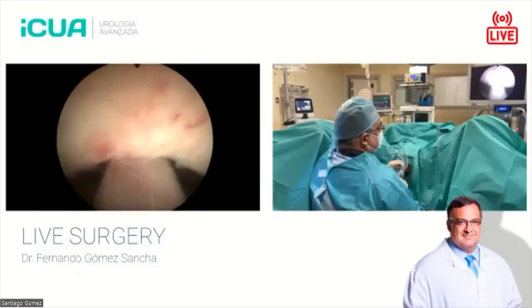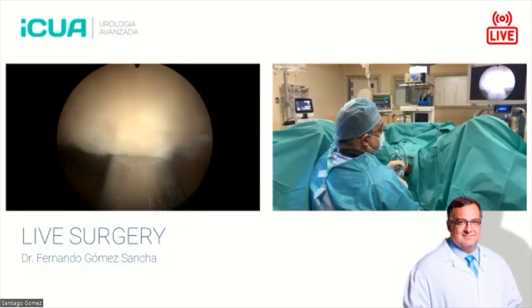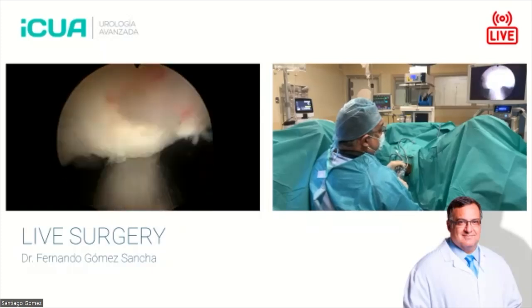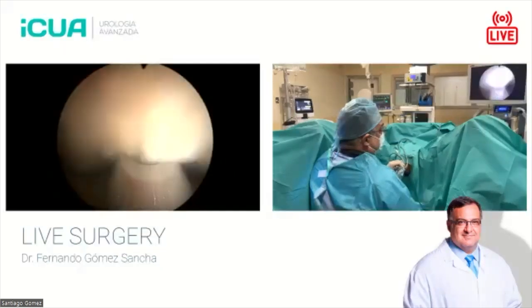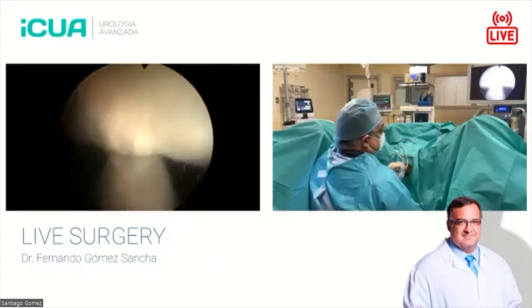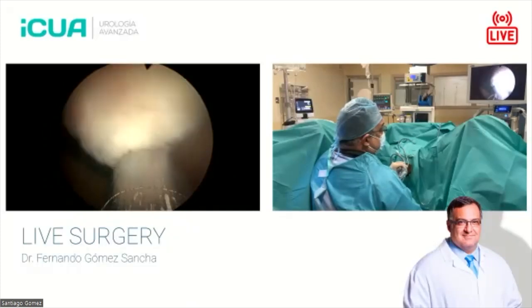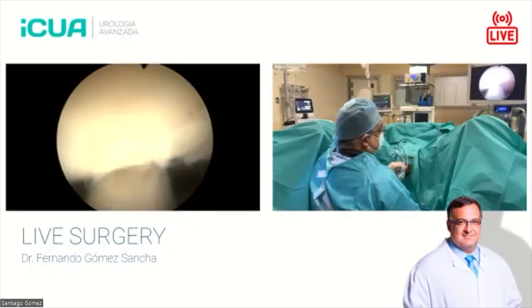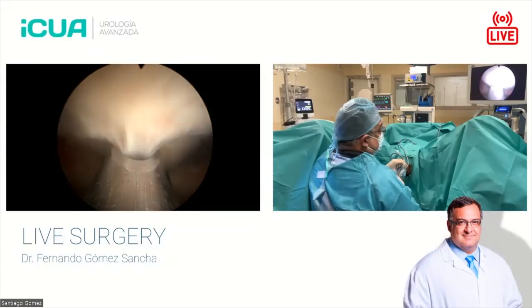But I discussed with Felipe recently, because he was publishing a lot on Twitter, saying in the small prostates, I leave at 12 o'clock a mucosal strip, blah, blah, blah. And when I asked him, he said, no, I don't do it anymore because these patients tend to bleed a lot afterwards. So I think these are hypotheses, and you shouldn't listen to the experts believing that everything they say is true, because many times it's their opinion, and their opinion is not science.